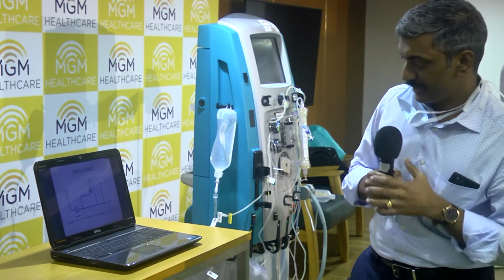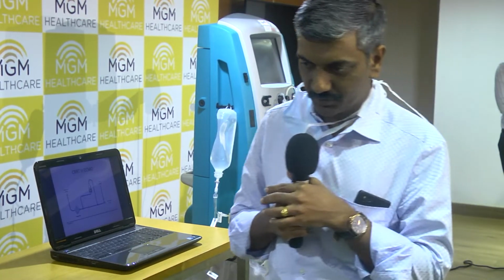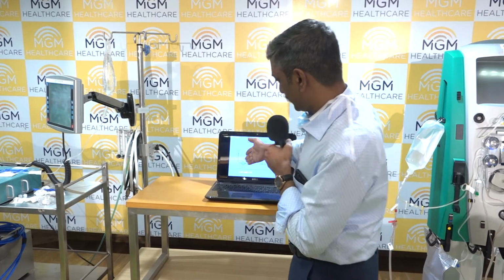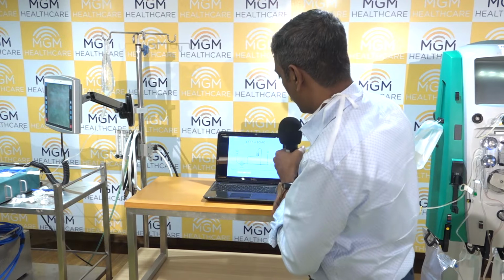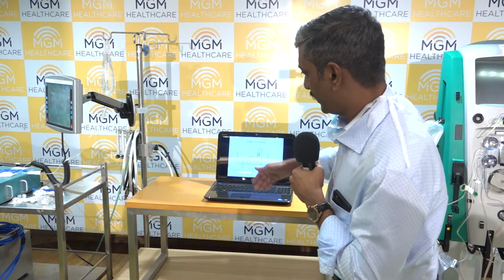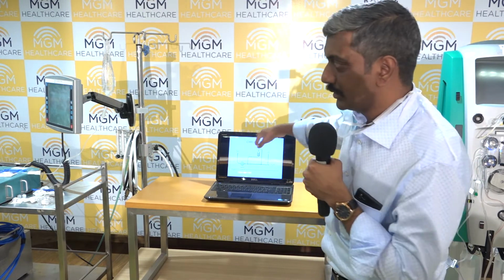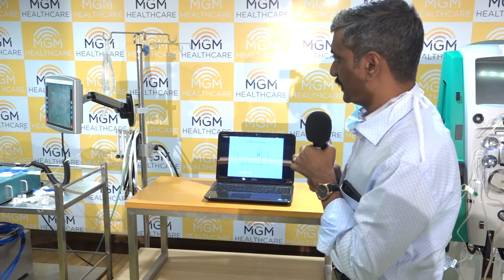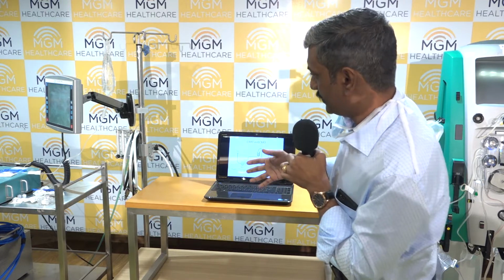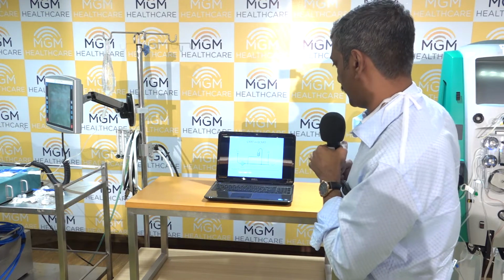The advantage here is the return line is given before the oxygenator. So even if any small air bubble or clots are there, it gets filtered in the oxygenator. But the only drawback is, since the access line is coming after the pump, your pressure to the CRRT machine will be very high. These machines are set for a certain pressure. If the pressure is high, they don't work. To avoid this, sometimes we put a partial clamp in the access line so that the pressure is not high in the CRRT.